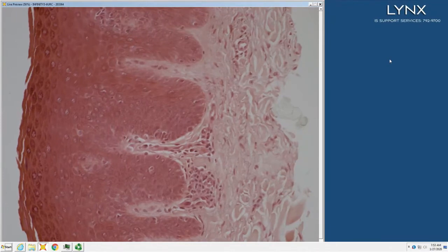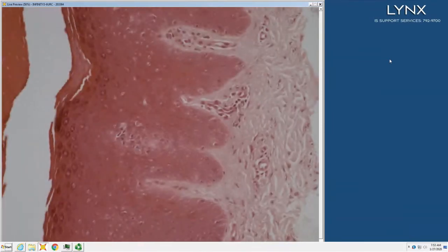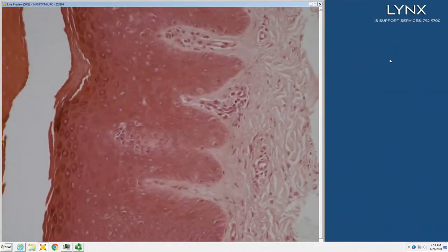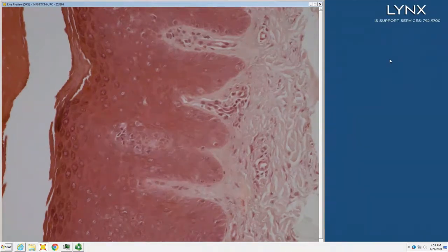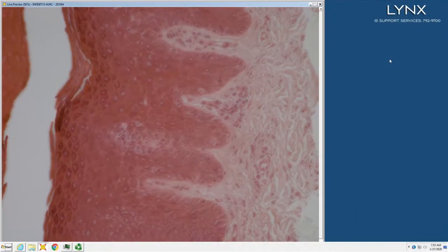They're pretty big, right? And they're sitting tagged at the DE junction. And then the next question you're going to ask is, is there papillodermal fibrosis? So do you see collagen bundles above the postcapillary venule? There should be none. In this case, I definitely see bundled ropey collagen above the postcapillary venule. So I have papillodermal fibrosis, and although they're not large in number, I have large lymphocytes sitting at the DE junction.